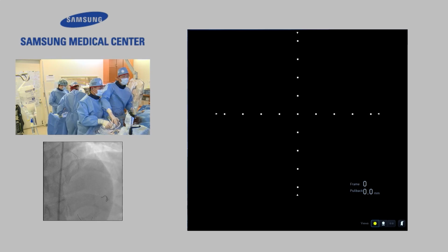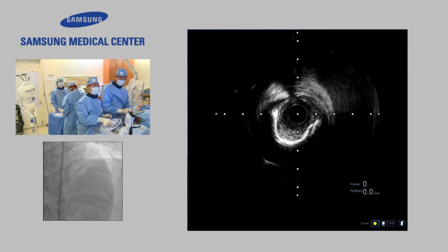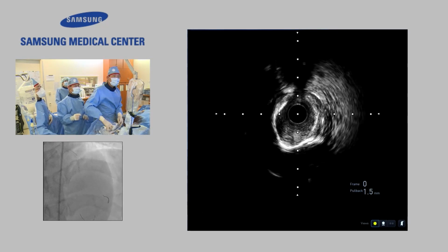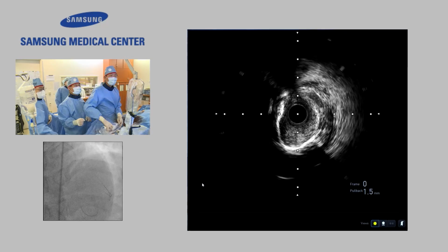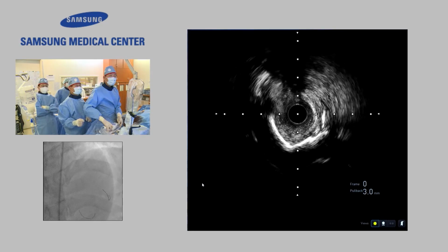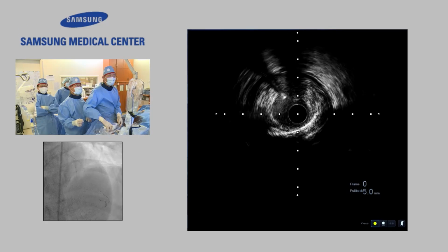You want to come back or just finish it? According to the IVUS finding, we can discuss the two-stent or one-stent strategy. This might be the final visit. This is the distal to diagonal. Where is the wire? We can see the wire here.